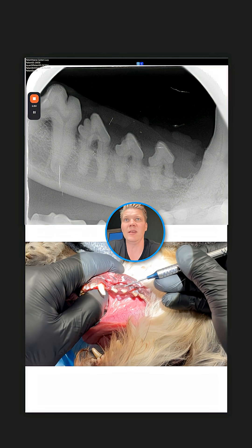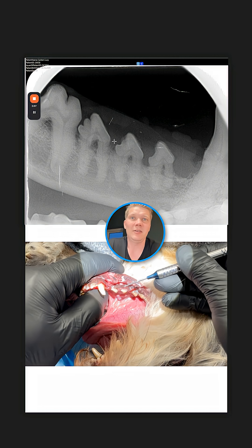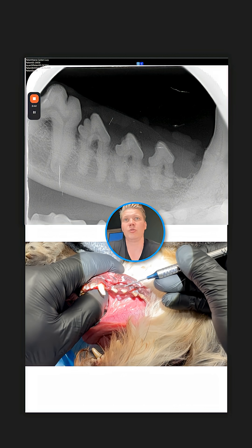With tooth 408, you can see this dark, loosened area and some breakdown — you start to lose tooth substance. This shadow extends into the crown, so this is a clinically apparent tooth resorptive lesion that is exposed to the oral cavity. We have to extract this tooth.